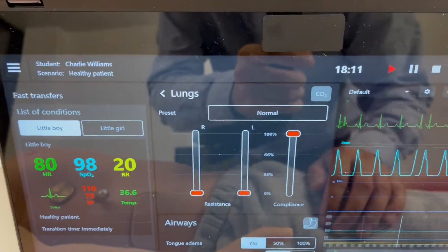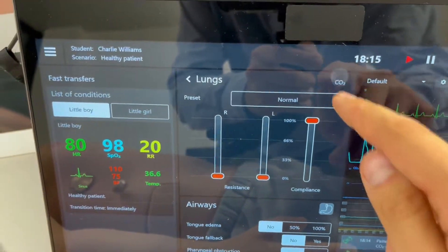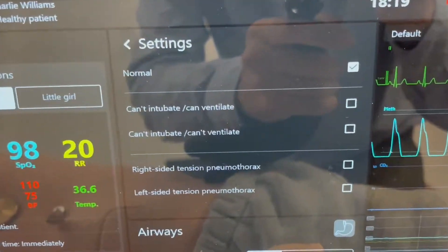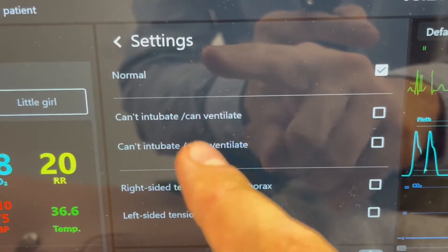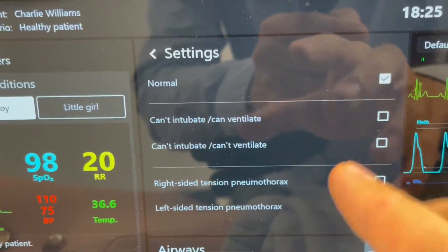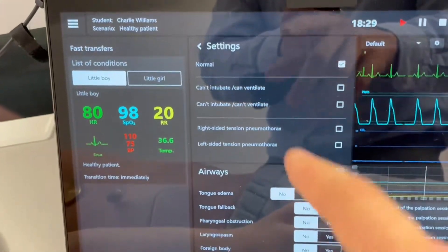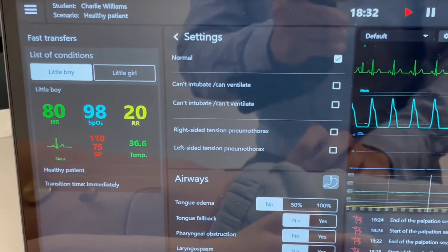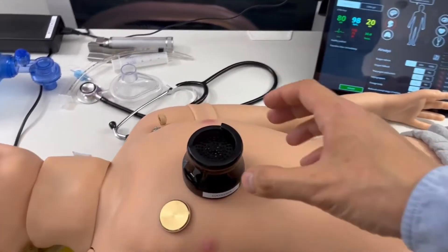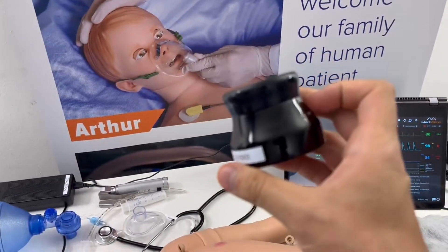When you operate the compliance slider you'll get a more realistic picture. You can also now toggle exhaled CO2 with a press here. If you go to presets, you can now access presets for 'can't intubate,' 'can't ventilate,' and 'can't intubate, can't ventilate.' Previously you had to configure this with all of the individual settings, but now you have these toggle commands — a solution familiar to Med Vision users.